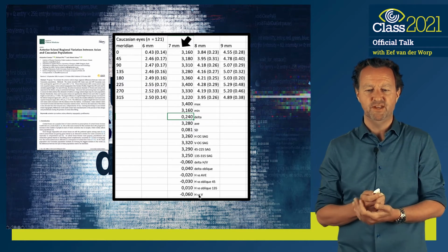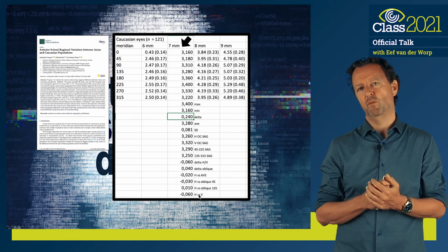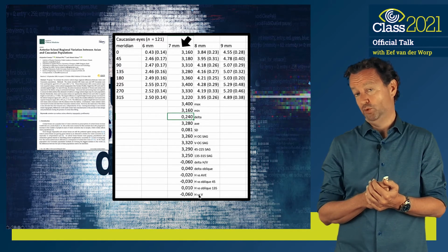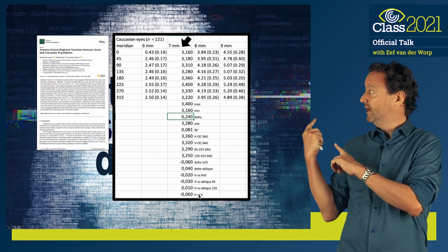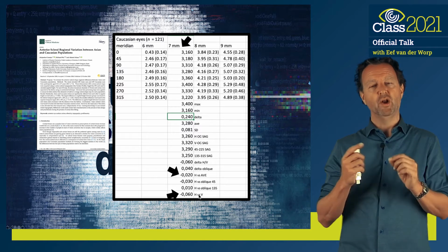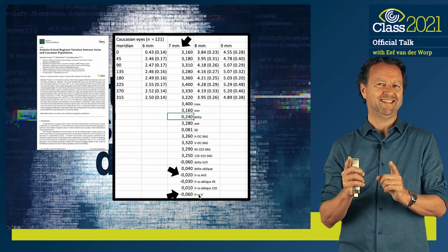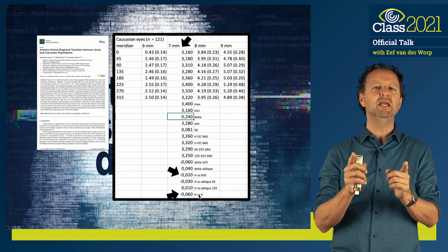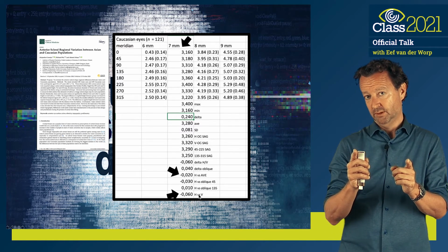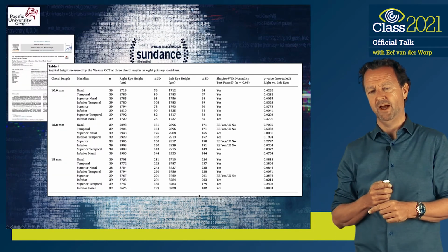What you can see here is that the average differences within one eye actually add up to 200, 240 micron, as you can see in the table here. On average, it doesn't look too bad actually. So what that says is that you can maybe use the horizontal sagittal height to sort of predict what the overall eye looks like.